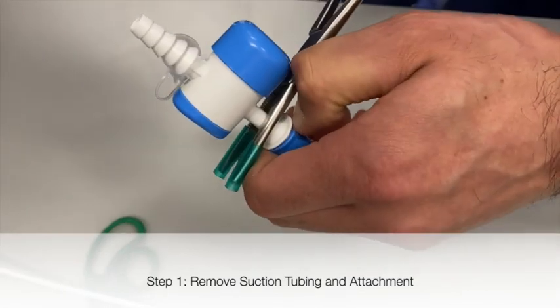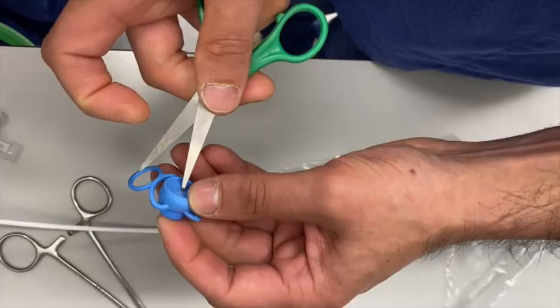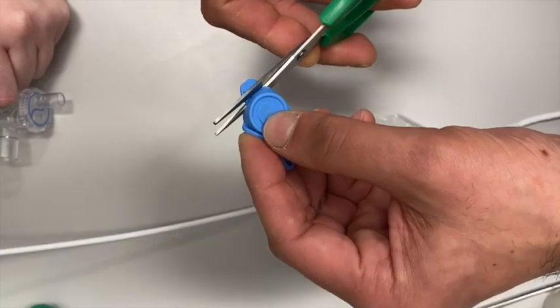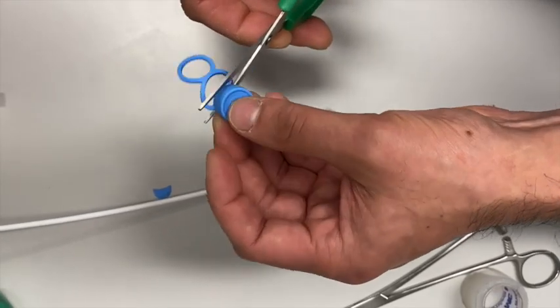First, the suction tubing is removed from the safety sheathing as shown here. A small hole is punctured in the safety plug, and the edges are then trimmed to create a circular shape.